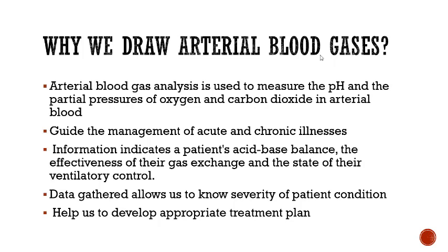And I'll give you an example of how that happens in the clinic. So if I draw a blood gas on a patient and those results come back abnormal, it is my responsibility to directly report that to the physician. Now, I might be working with a first-year resident who's not a pulmonologist, whose expertise is not at all in the intensive care or in pulmonary, and they are going to rely on me to interpret that blood gas for them. And it's not that there's anything wrong with them not knowing that.